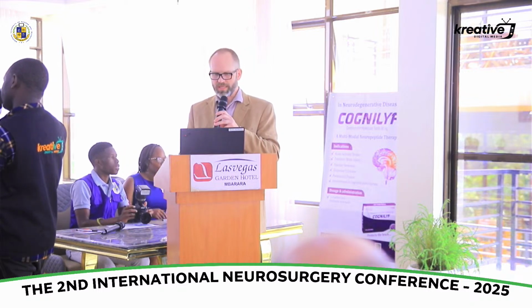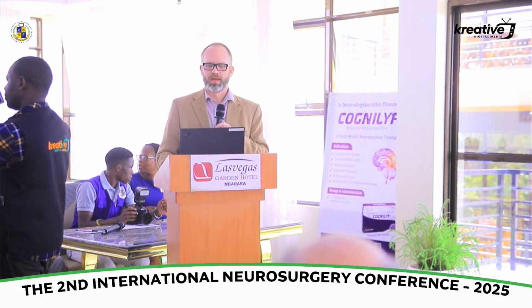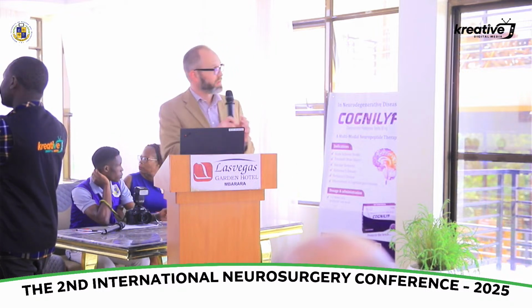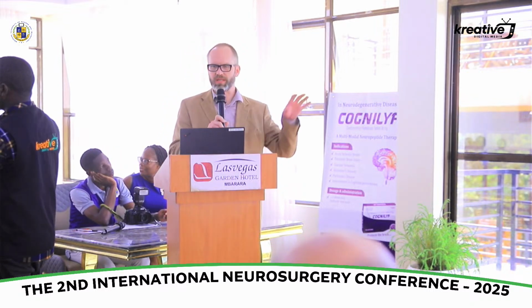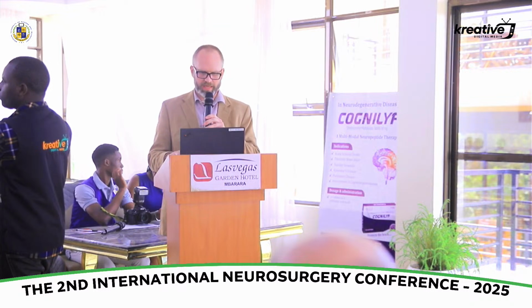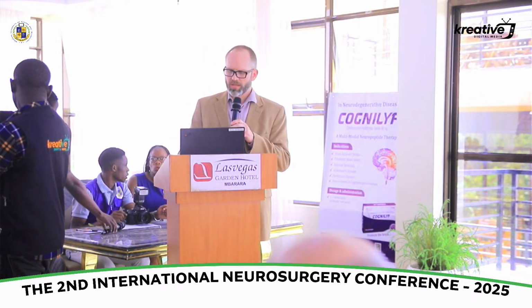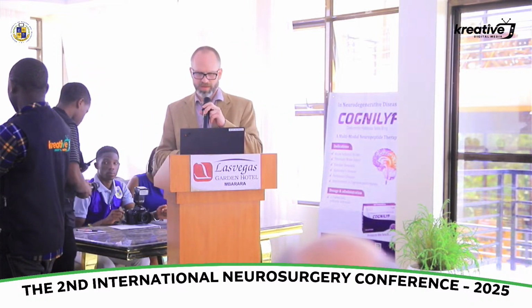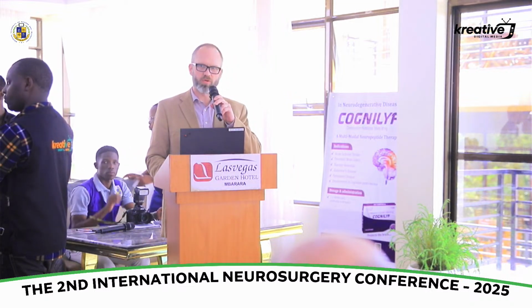But what you can see here is normal brain tissue. So A is normal, and B is tumor tissue, and you see that the tumor tissue is much more dense, you have much higher waves and it's clearly distinguishable, demonstrated on the left in panel A. So that was the first demonstration in humans of the potential for ultrasound in neurosurgery.